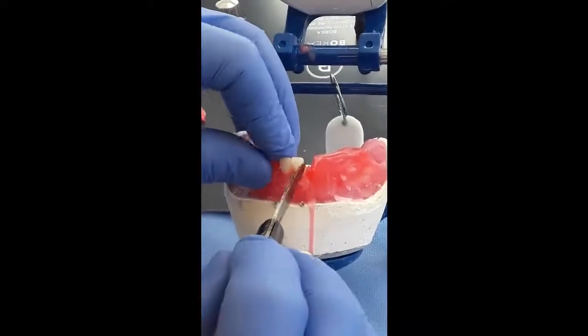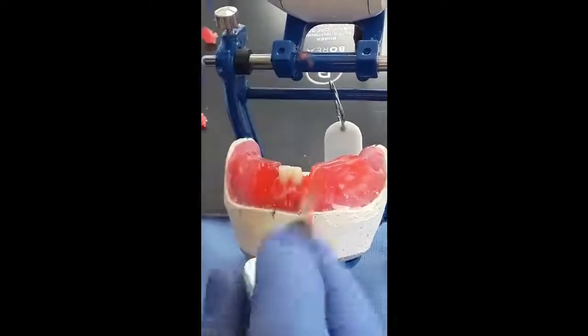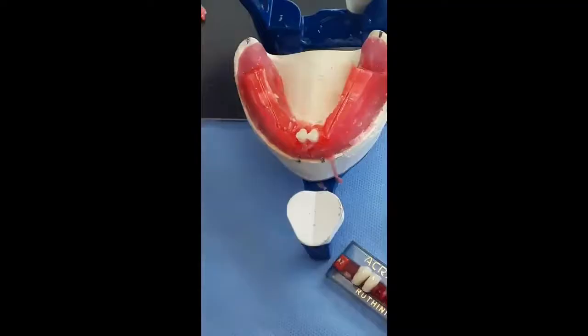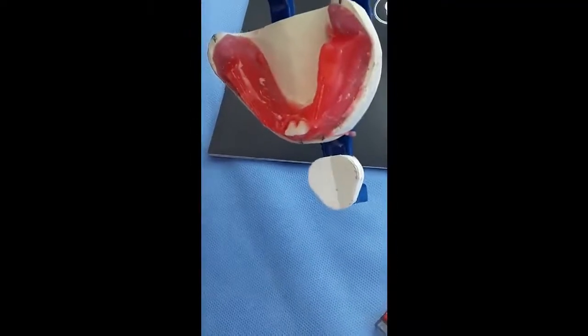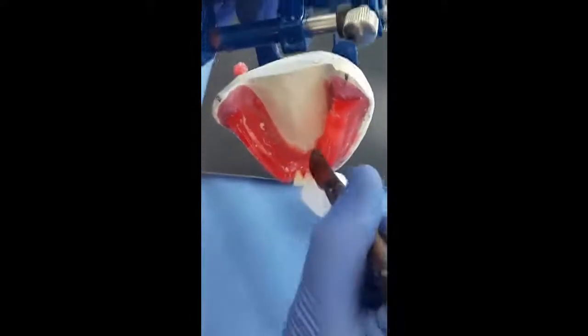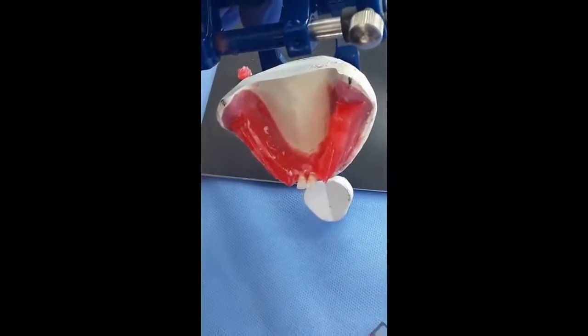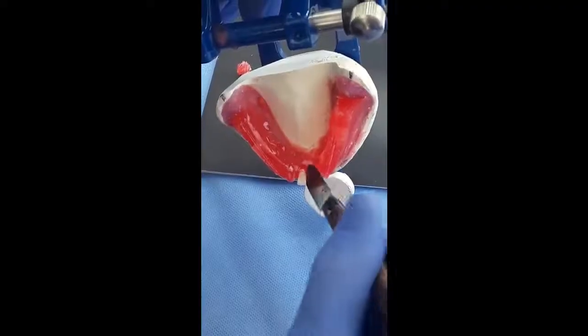The long axis of the teeth should be perpendicular, and if we look incisally, we have to fix the tooth also from the lingual side by melting wax around it.